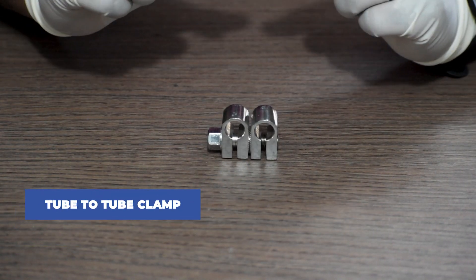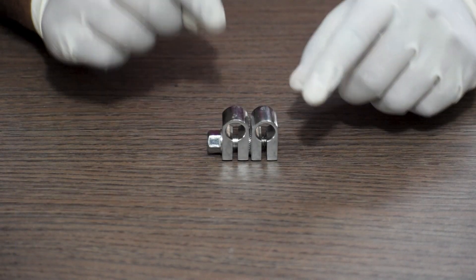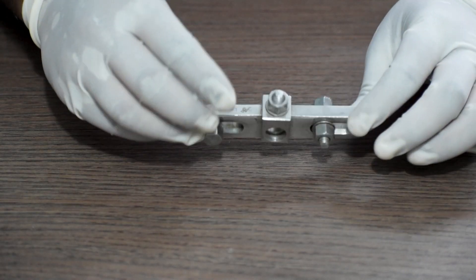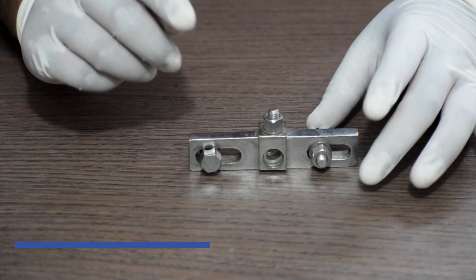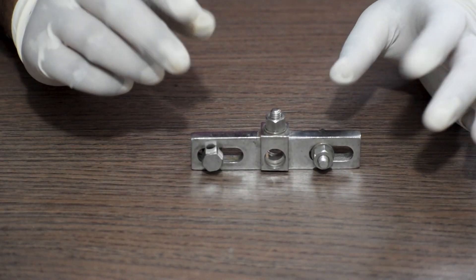Next, this is a tube-to-tube clamp. This is a transverse T-clamp used for fixation of pins on both sides — the tubular rod goes in between.